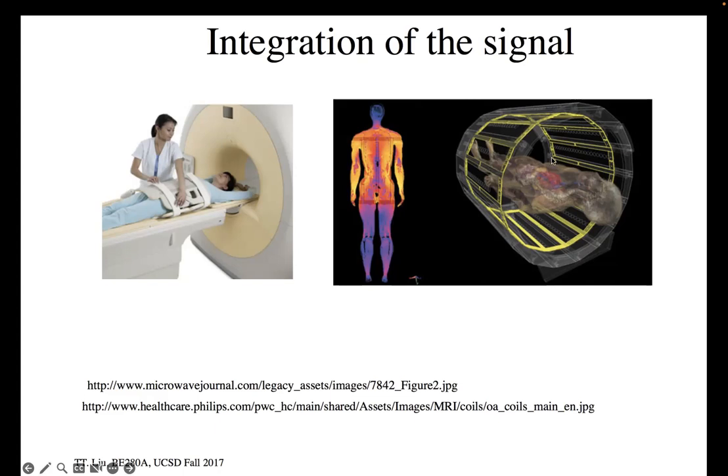As you can imagine, if I have current going in a circle around this way, so current going down this way and coming back up this way, I make a magnetic field pointing upwards. And then what I can do is change the phase of the current in these rungs such that the magnetic field doesn't just point upwards, but starts to rotate. And it actually rotates in this transverse plane, the XY plane.